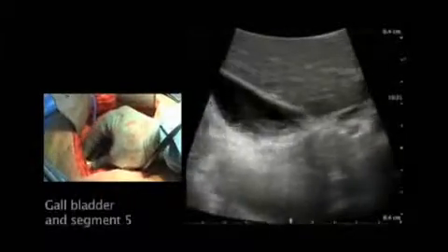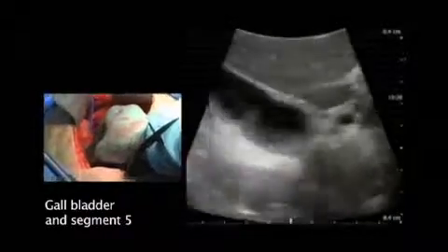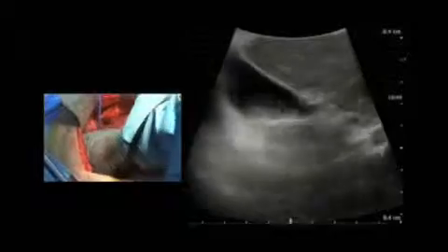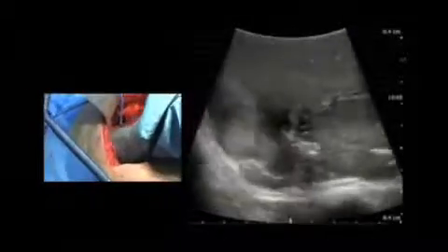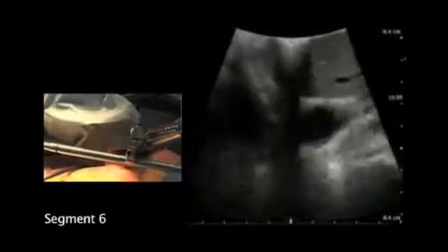we will also be able to see the gallbladder, which is coming here in segment number 4 in front of it here, and segment number 5 laterally to it. And if we continue more to the side, then we are actually getting the liver towards the diaphragm and the ribs, and in the top part of it, the more cranial part, we will have the metastasis. Then the segment number 6 is the more caudal part of the right liver lobe.